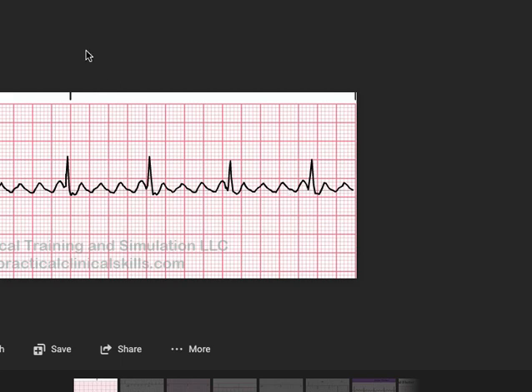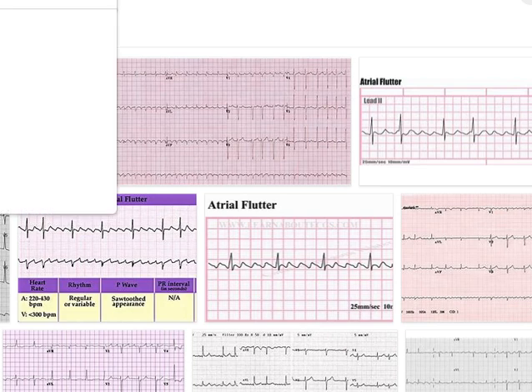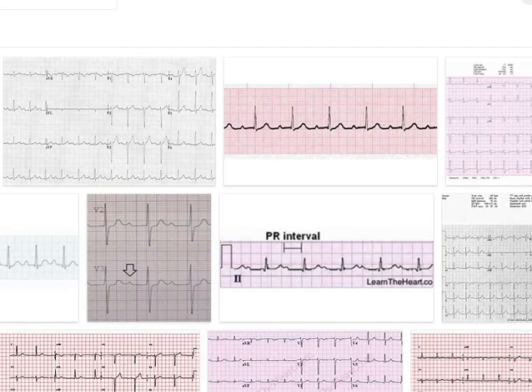By the way, it also makes me talk about the heart blocks. Maybe you guys are confused about what a heart block is. Heart blocks are of three types: first degree heart block, second degree heart block, and third degree heart block. For example, I will show you a first degree heart block ECG. So what is first degree heart block? Simply, there is some block in the conduction system between the atria and the ventricles.